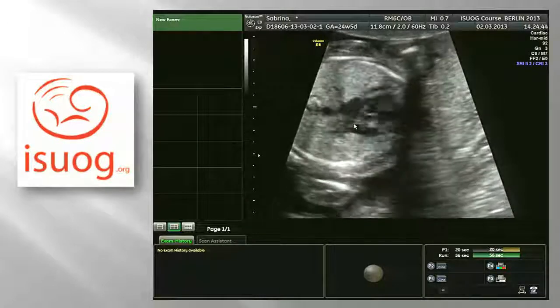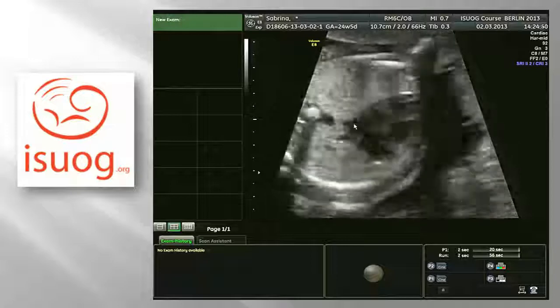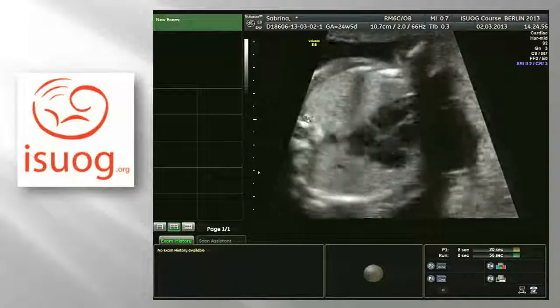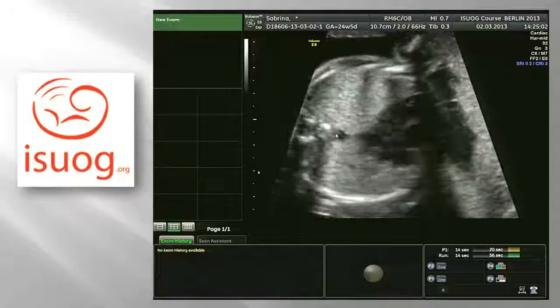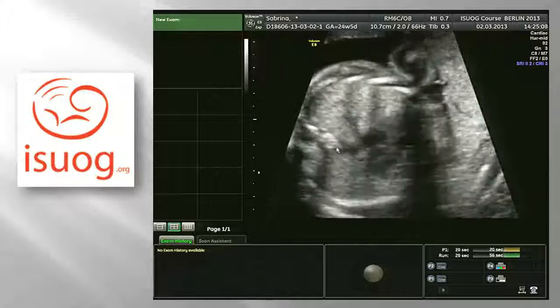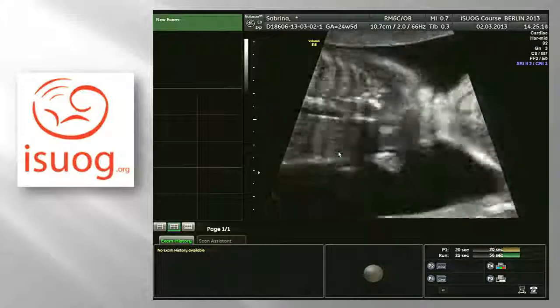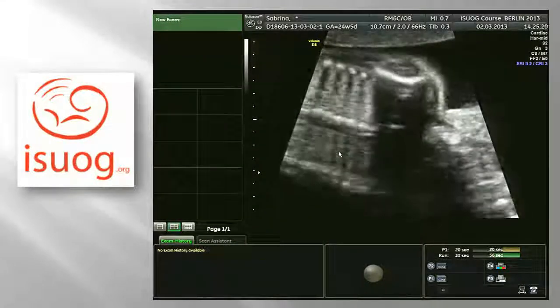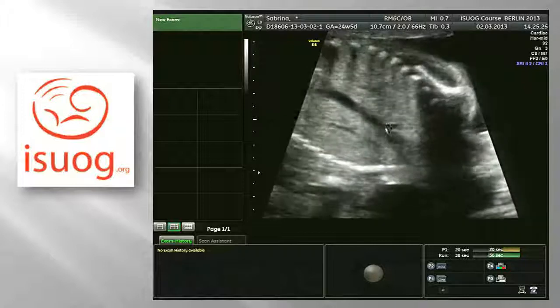Can you get again a four-chamber view, Kai, and show where the descending aorta is in the four-chamber view? So when we go back to the four-chamber view, stop. We have the left ventricle, we have the aorta, this is the spine. This means at the level of the four-chamber view, the aorta is going back to the, maybe I think it's in the middle, it's not really on the left. In the upper abdomen, it is on the left. And when I go up, it is right. So what we search for when we look for a double aortic arch is we go in a longitudinal view, and we come from the spine, it's a coronal or frontal view, and we go inside the baby. You see the aorta.